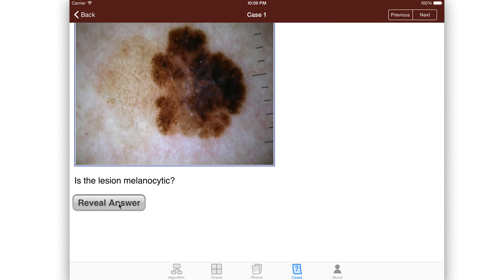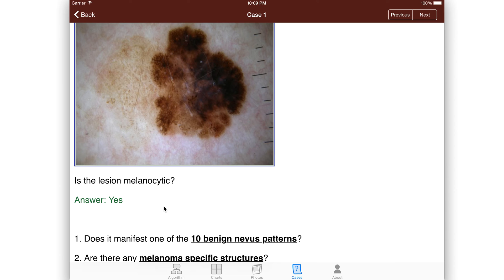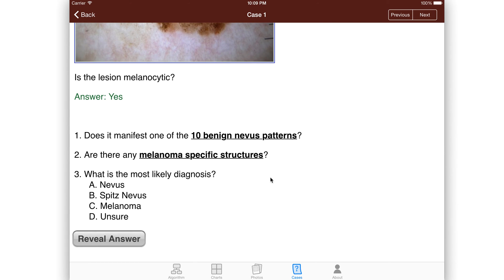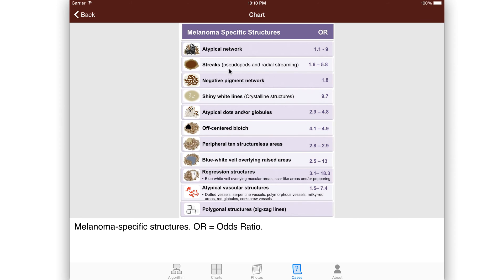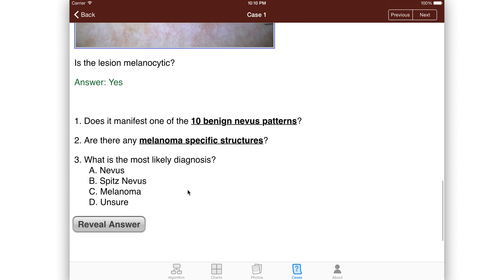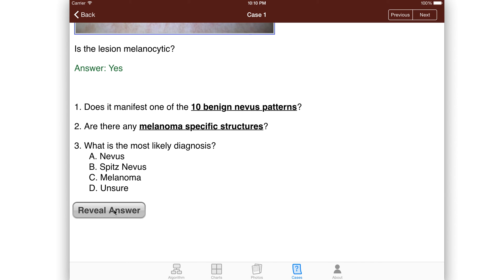You'd say that to yourself, reveal the answer, and the answer of course is yes. Specifically, since I actually saw this patient, took those pictures, and wrote this case. When you're doing it and you're learning, you can then ask the next questions to yourself. Does it manifest one of 10 benign nevus patterns? The answer would be no. Are there melanoma-specific structures? If you're not sure and you don't remember what those are, if you click here, you'll get the list of the melanoma-specific structures. Then you can go back to the case and say yes, it does have some of those. So this is a melanoma, and you reveal the answer.